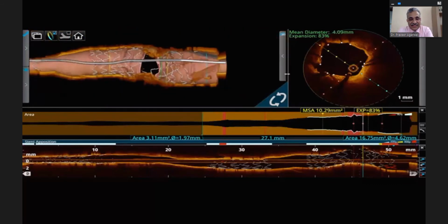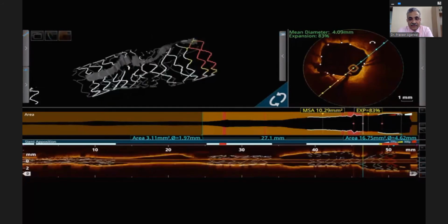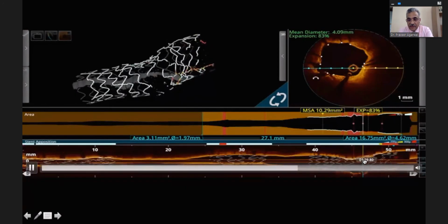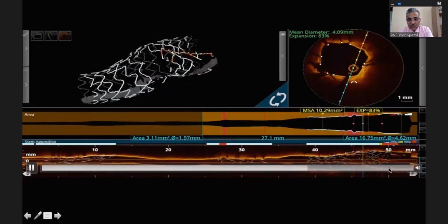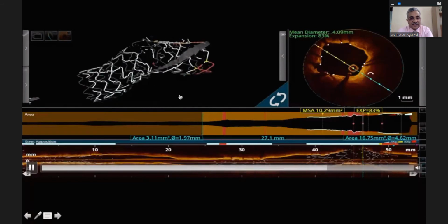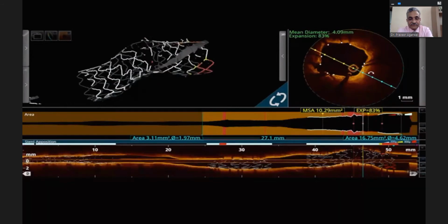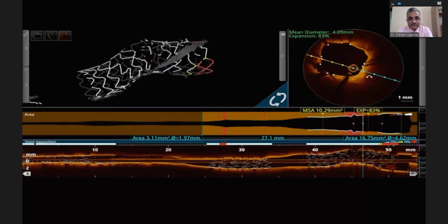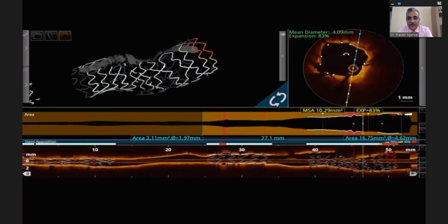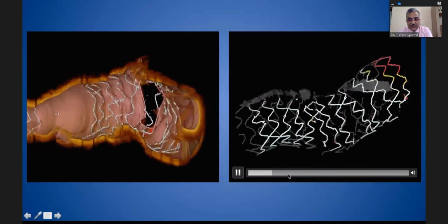That's obvious, that is the haziness which we were seeing on the angiogram. You see this picture? You see the struts are slightly more open than what they should be, and the proximal edge is not deployed, as you can see here also. And you see this, the struts are broken there. They are hanging. See the next picture. The same thing in zoom view, you can see all those struts have broken. There's no integrity of the stent at this place, but it is still holding on.